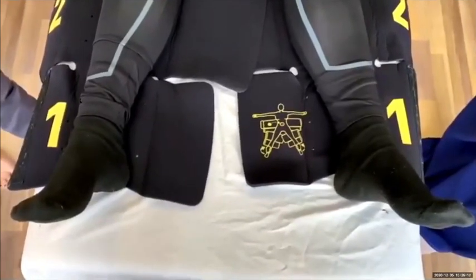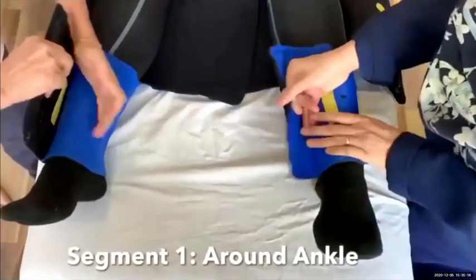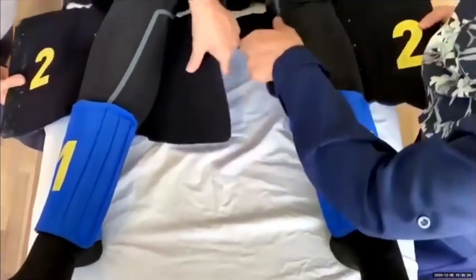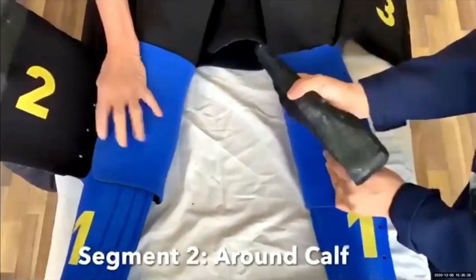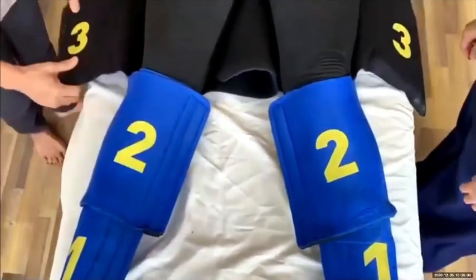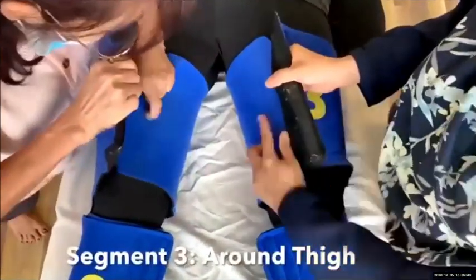Close segment one by tightly wrapping around each ankle. Place segment two tightly around her calf. Closing segment three — segment three should be placed tightly around her thigh.